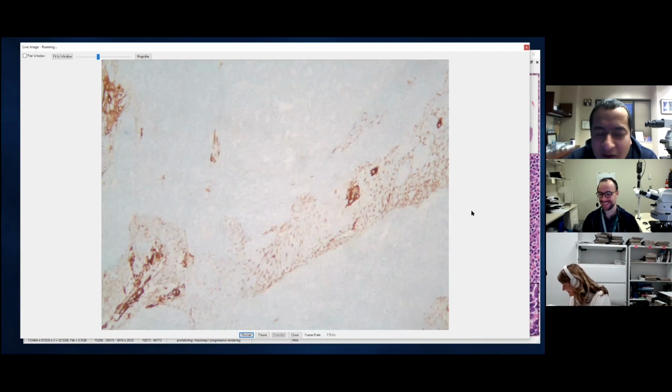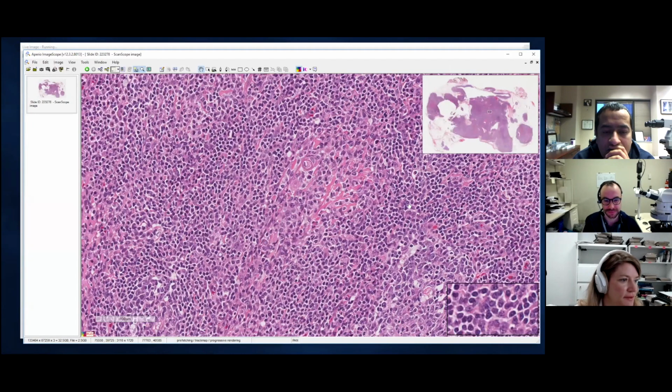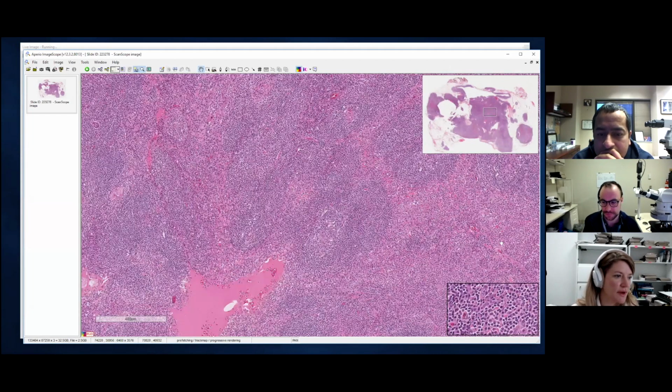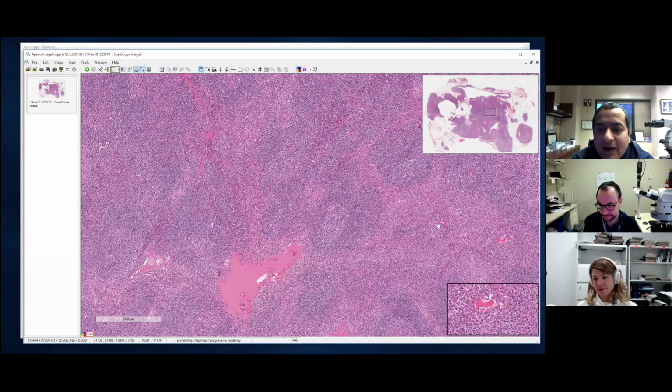Yeah, we might not have done it in this case. I think because there was just so much of the follicular and mature lymphoid infiltrate, and we did have nice evidence of the thymic epithelium there, they're fairly sure it was thymus. And I guess the differential in this case, going back to our H&E, we didn't see a lot of the immature cells that you would typically see where you're looking more like, could this be a lymphoblastic lymphoma or residual thymus?